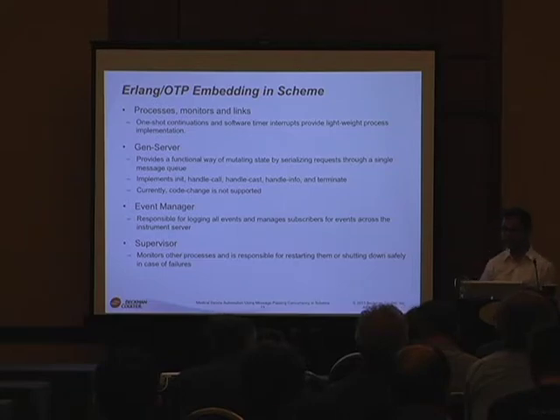We have basically implemented the Erlang model, and if you're familiar with it, the init, handle call, handle cast, handle info, and terminate. We didn't actually implement the code change part of it just because we never felt the need for it. I don't think the FDA would appreciate us just changing code on the fly, so that was there.